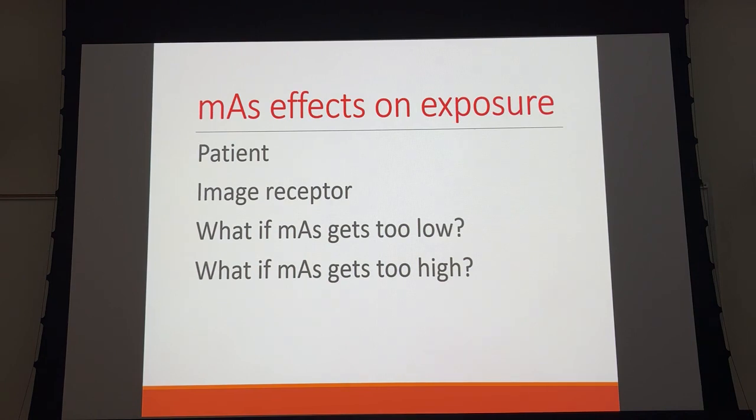We didn't really talk about this, but you could flood your image receptor's individual detectors with so much information that you can lose contrast. But that's an extreme exposure. You know, you accidentally set something like an abdomen exposure for a hand or something like that.